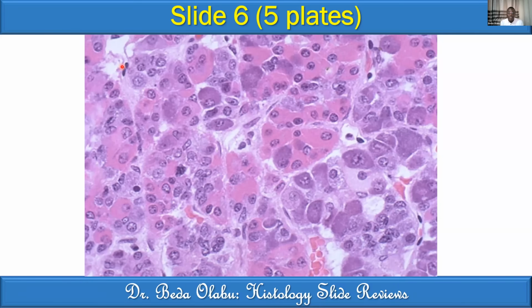They're the supporting cells of the anterior pituitary. Remember, supporting cells of the posterior pituitary are pituicytes. Supporting cells of the anterior pituitary are folliculostellate cells. Lastly, the other thing I want to capture is that just like neurohypophysis, even adenohypophysis is heavily vascularized, and those are blood vessels you're seeing.